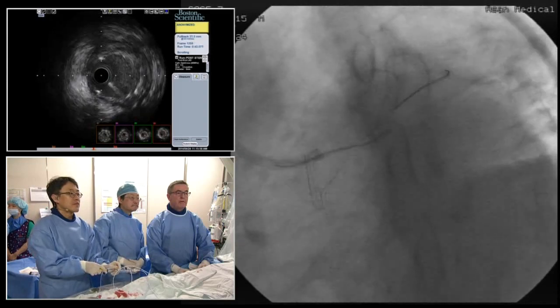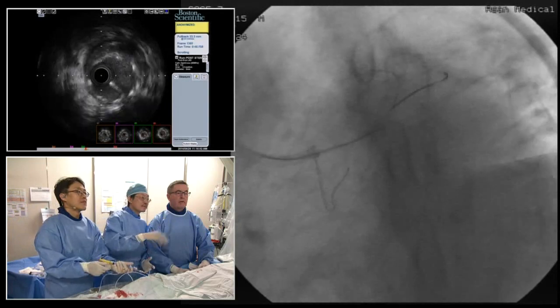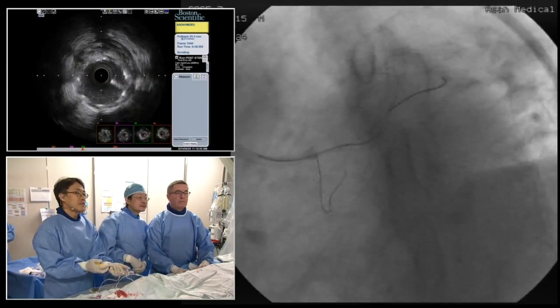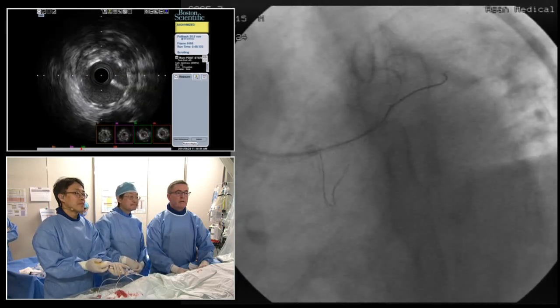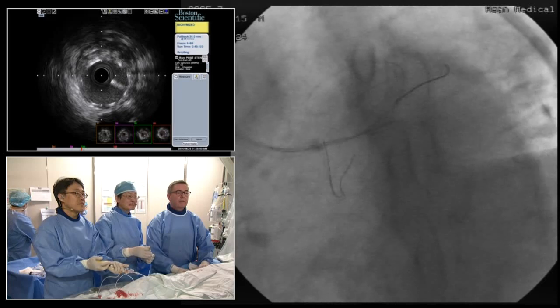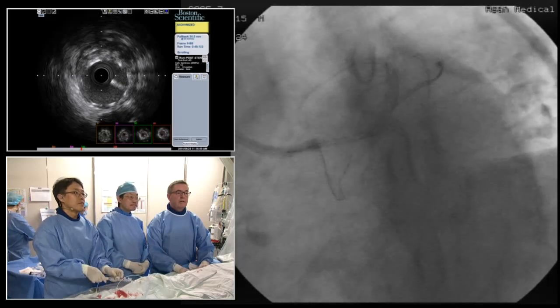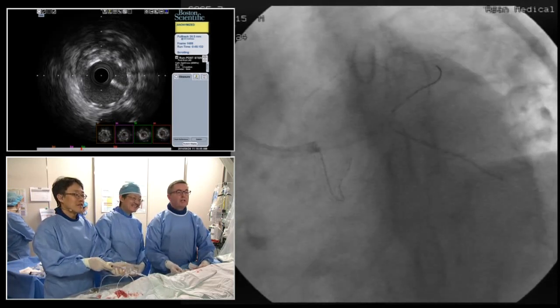Maybe it needs to reshift the wire. Maybe the primary curve is not good. We'll get him, don't worry. There just may not be enough angle on that wire. That's right. Turn it into the circumflex. There you go. Very nice. It's the right cell.